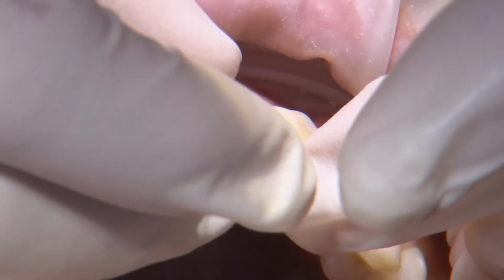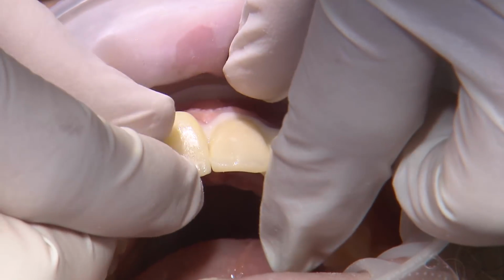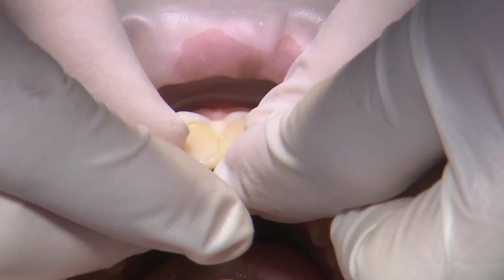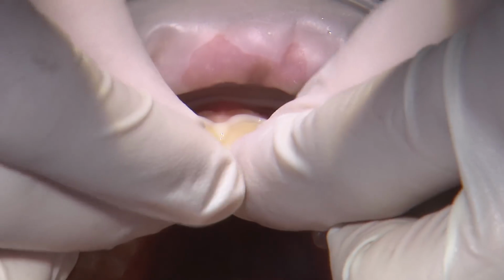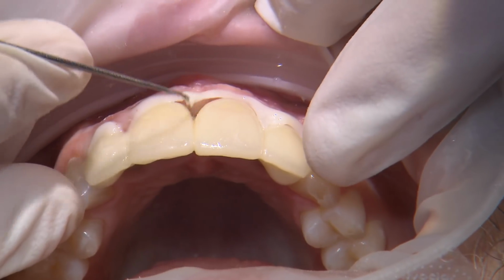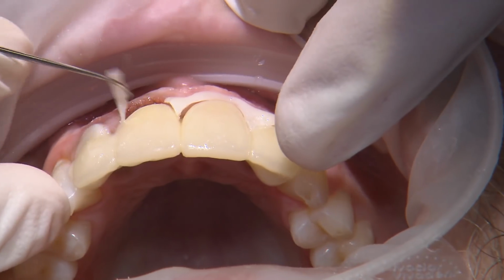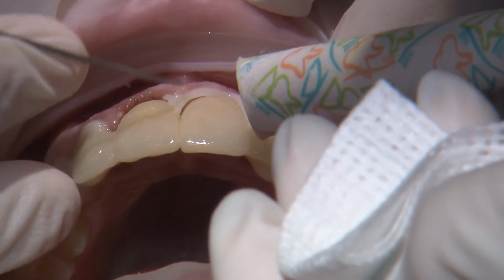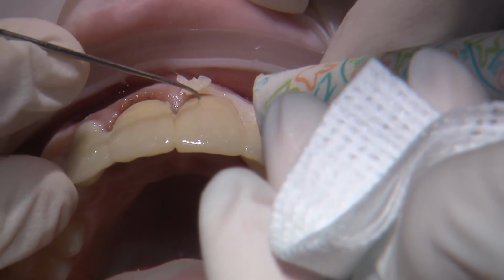One of the most challenging situations when provisionalizing veneers is keeping them in place while the finals are being fabricated. There's no temporary cement that I'm aware of that can keep these in place, and we don't have any mechanical retention to rely on. So I found the only way to hold these on is to bond these in at the center of the labial surface.